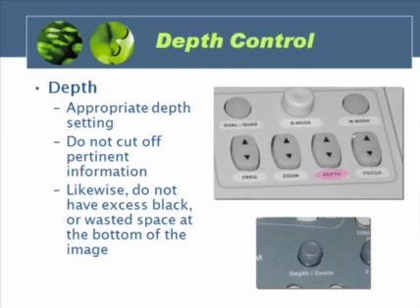Using the appropriate depth is very important. Not only do we not want to cut off pertinent information such as part of an organ or maybe even pathology, we don't want to have excess black in the image, or wasted space as I call it, at the bottom. Different manufacturers use different terminology for the depth.